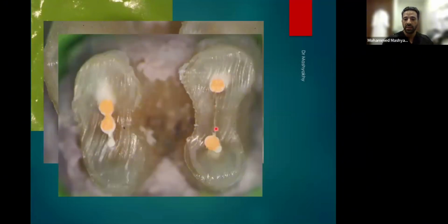See the other canal in the mesial, how it looks, it's not completely round. So in this one, it's better to use bioceramic sealer. You don't see this one, you don't know the anatomy inside. So it's better to be safe. Either do very good warm vertical condensation or use bioceramic sealer to be safe.